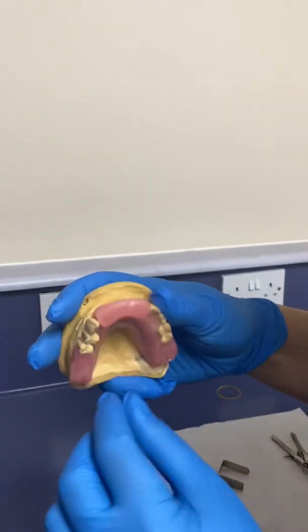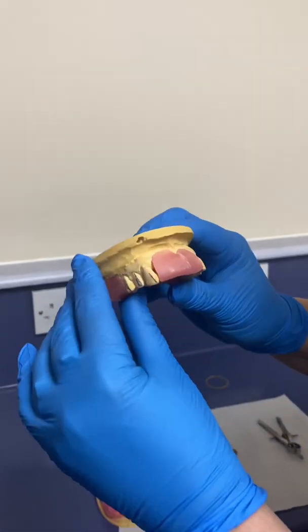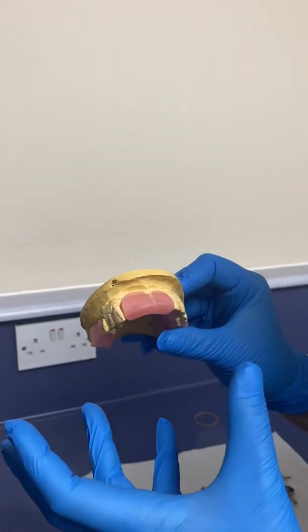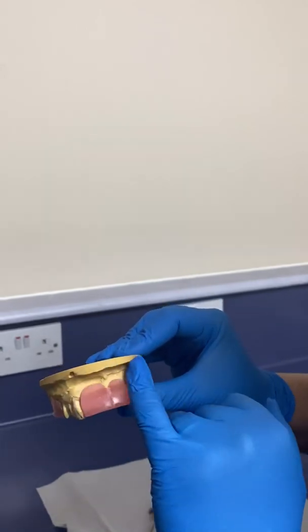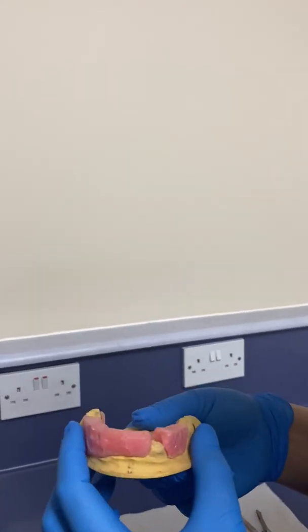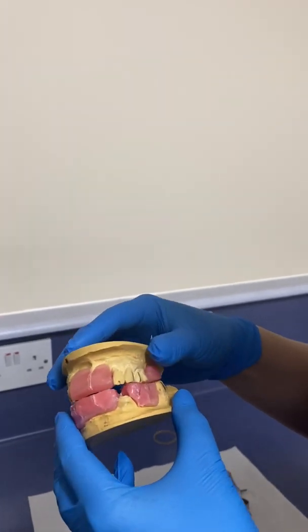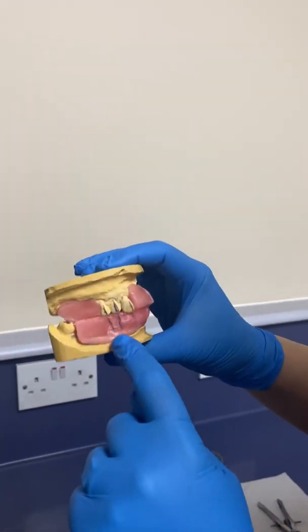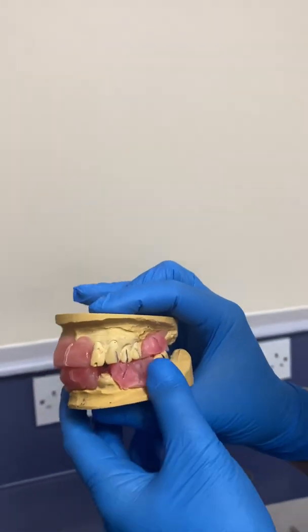We did the jaw registration one wax rim at a time. Best practice is to try the upper one in the mouth first, do all your measurements according to the upper wax rim, make sure it fits well, mark the center line, and have the wax rim at the correct labial profile. Then put the lower one in and do the same, and once that's done, put both in together to measure your freeway space and measure your OVD. In this situation we did some markings so the technician knows that all the markings have to align when putting it together.